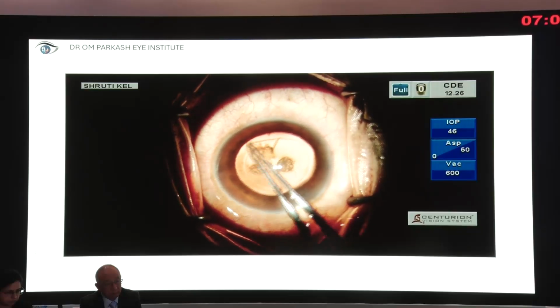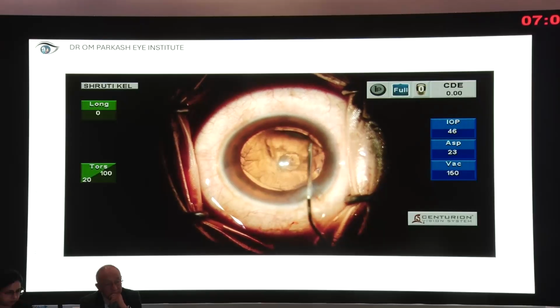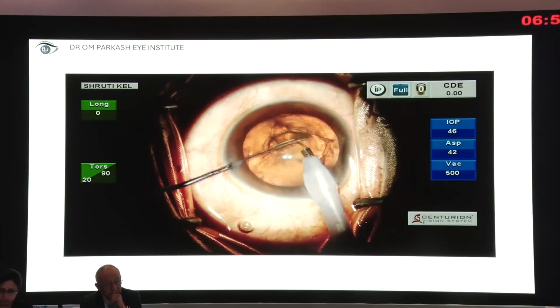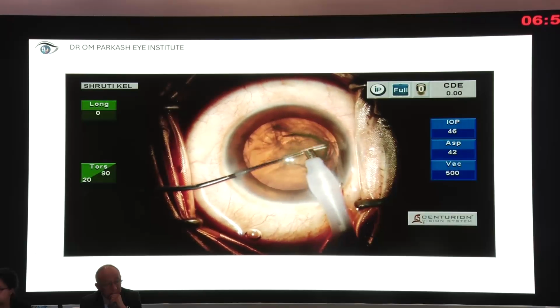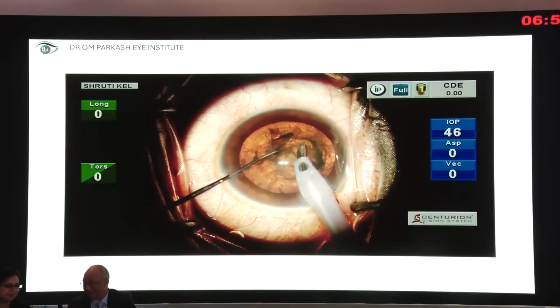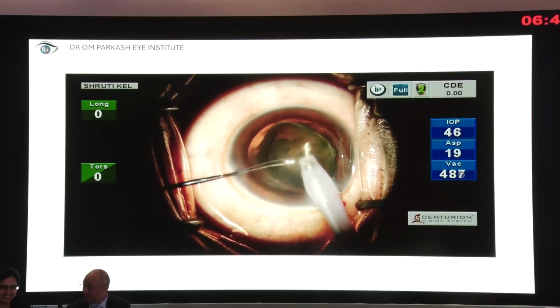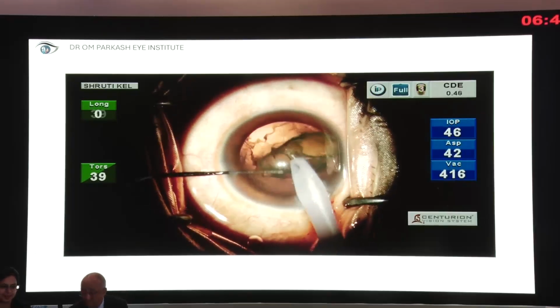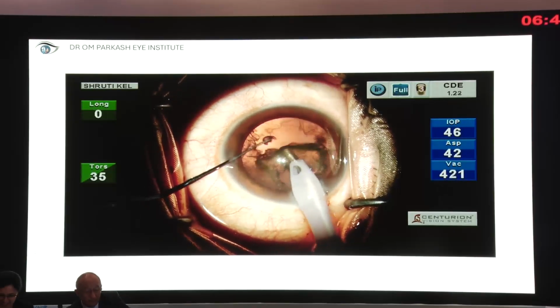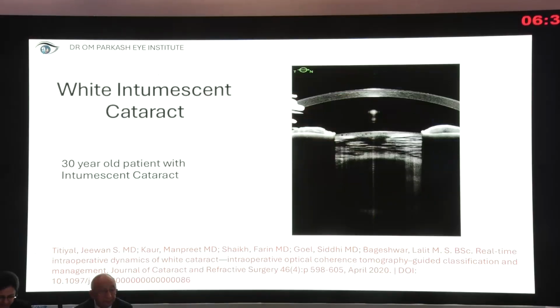And then you do a multiple point hydrodissection at different points so that you break down all the corticocapsular adhesions. And once it is broken, the second hand instrument helps in rotating the nucleus, and then alignment of the tip sideways towards the second hand instrument, placement of the tip at the nuclear rim, impaling and devouring or emulsification at the level of iris plane away from the posterior capsule. The phaco tip remains at the safe zone and you're able to complete the emulsification.